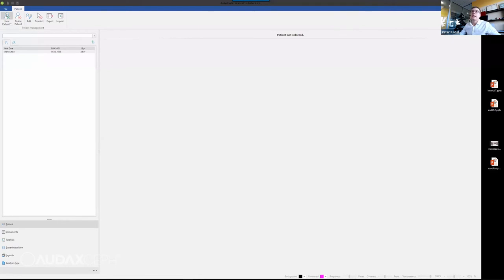And I do so by clicking new patient, and I will say Jenny Doe. It's always Jenny Doe or Julie Doe or whatever. She was born on 1st of 02. She's a female. I can add phone number, GSM, additional information, so cell phone, address, and so on. When I save the patient, what I get is a patient here on list of patients.